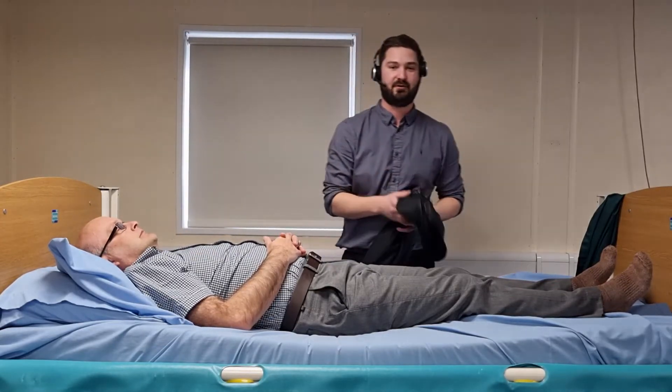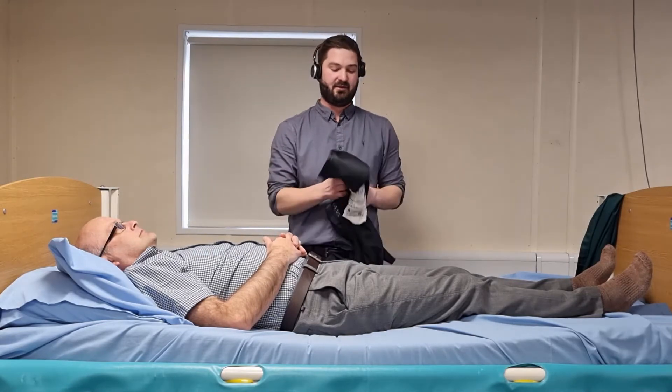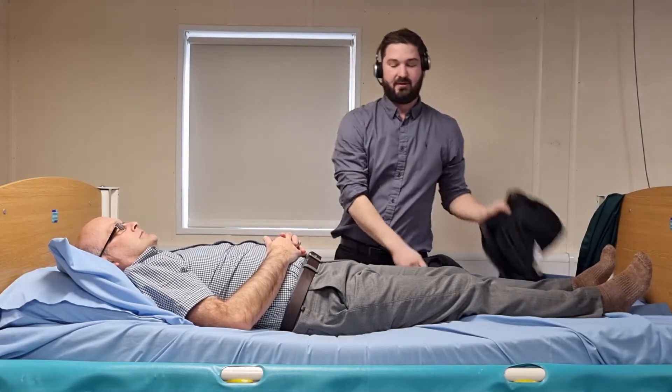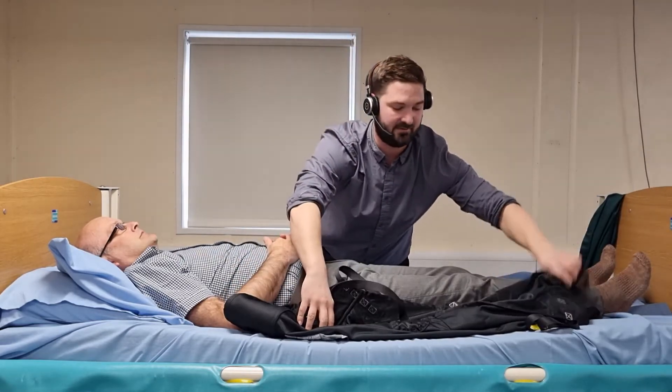This is the fitting and removal of an in-situ sling in a lying position. This is the in-situ sling I'm going to be using for the demonstration. First thing I'm going to do is lie the sling on the opposite side of the bed ready to be fitted.